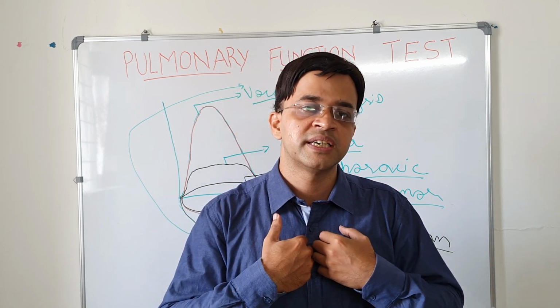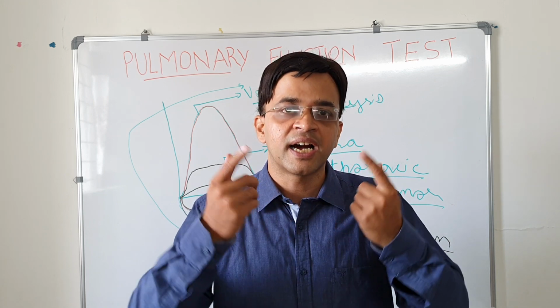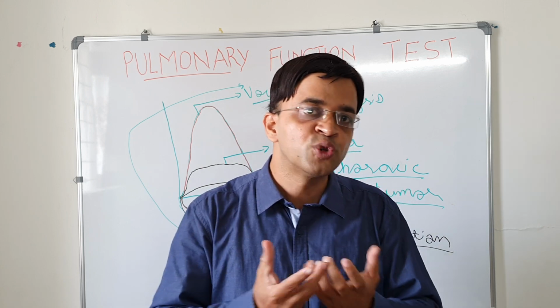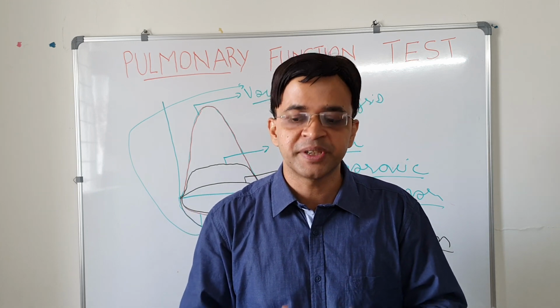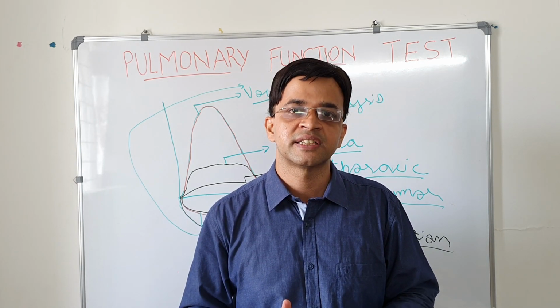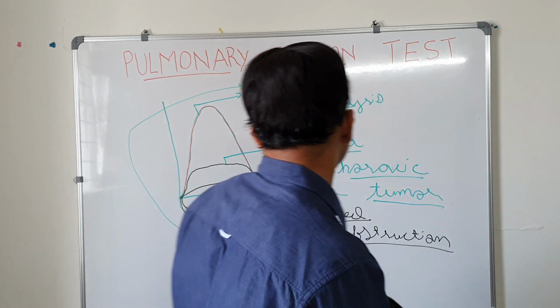That is why asthma shows coving on the expiratory loop, and vocal cord paralysis blunts the inspiratory loop. But if the tumor is big and fixed, it's going to blunt both our inspiration and our expiration. Okay, then we will go into how to interpret these signs. I mean, how we should interpret the values we get in our pulmonary function tests.